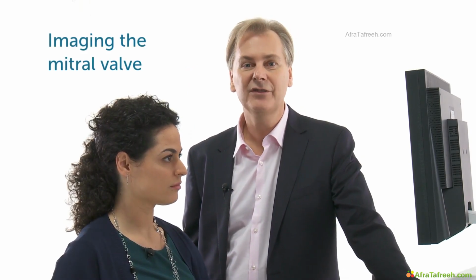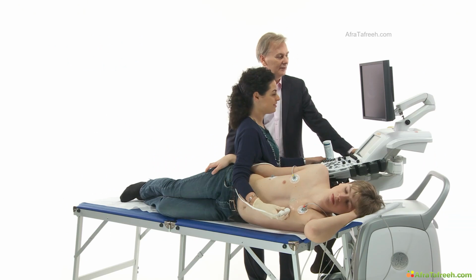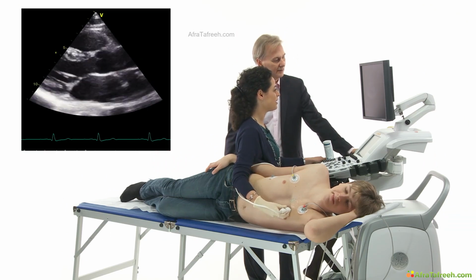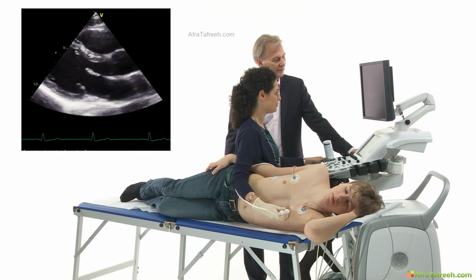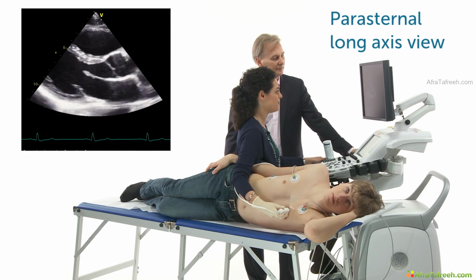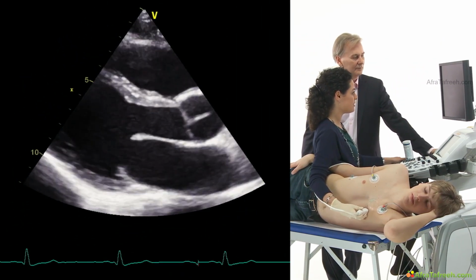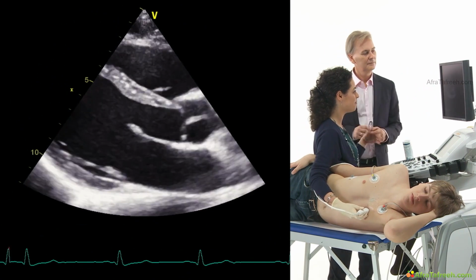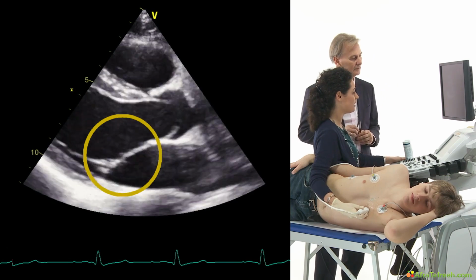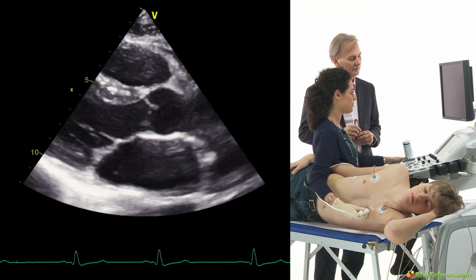From video images of the mitral valve to the mitral valve we see with echocardiography. Exactly, Thomas, here is the mitral valve. I guess our colleagues are already able to recognize this view. We are using a parasternal long axis view, but now our focus is on the mitral valve. So we can see the mitral valve is really opening during diastole and closing during systole. I think it's a normal valve. What do you say, Thomas?